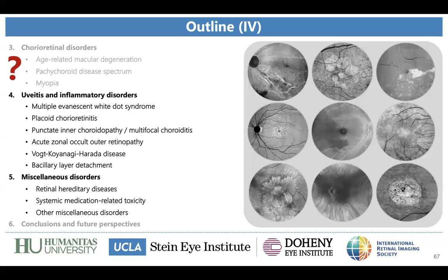Thank you, Alessandro. I think it will be the only point where I can add something to this presentation, because I have a retina fellow, Jessica Galvan. I think she is here. I don't know. We found in a few cases of central serous chorioretinopathy, using en face OCT, the correlation of the hypertransmission defects with the leakage points in the acute phase.